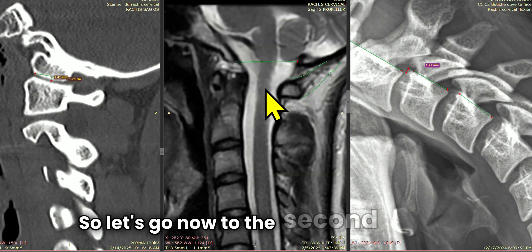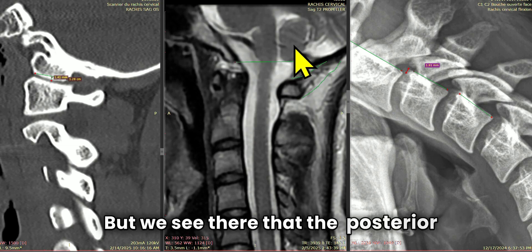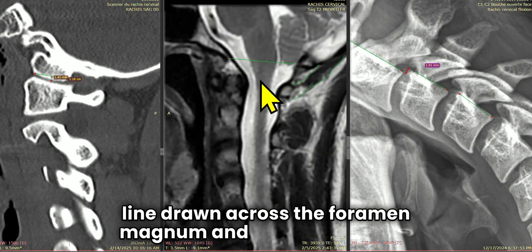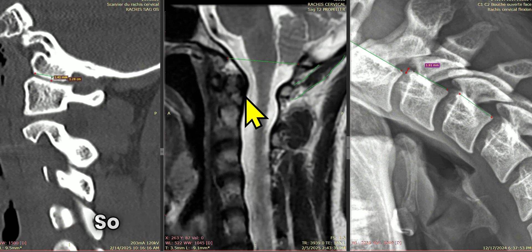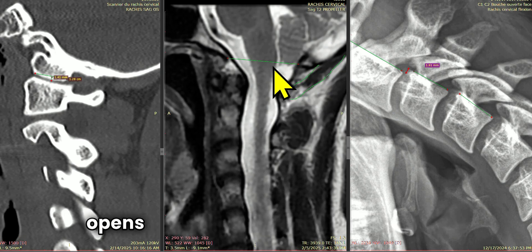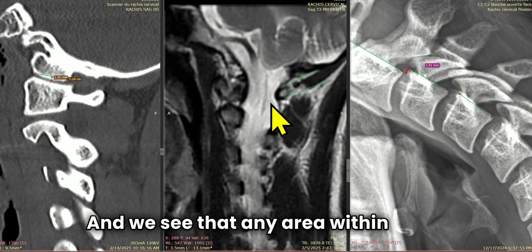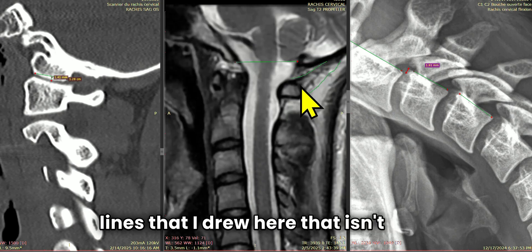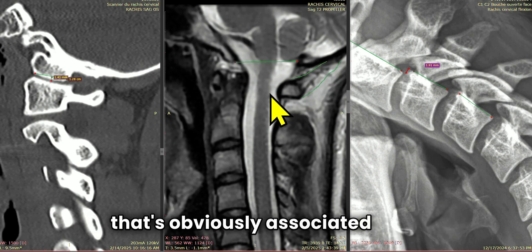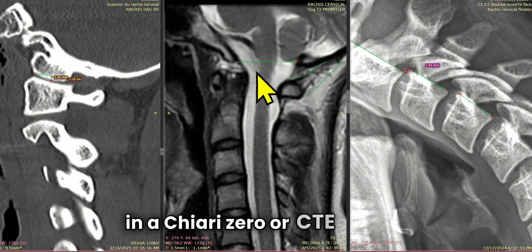So let's go now to the second pane here. This is the MRI. It's not an upright MRI, so it's going to underestimate Chiari. But we see that the posterior cerebellar tonsils here just touch the line drawn across the foramen magnum. So there is a Chiari 0 or CTE. Now this becomes significant. And then if we look at the rectus capitis posterior minor, that actually opens the door back here for CSF flow. And we see that any area within these lines that I drew here that isn't dark means that the muscle is atrophied.